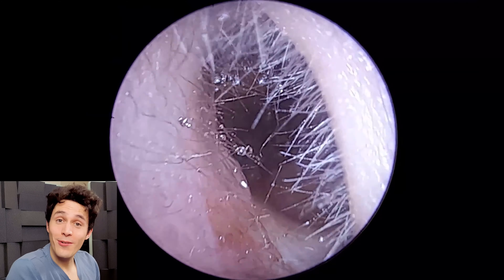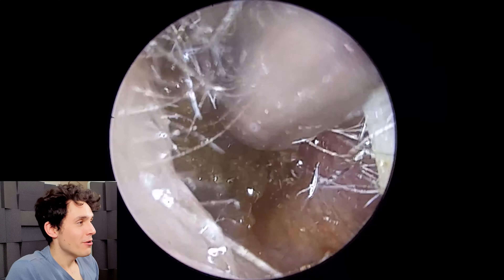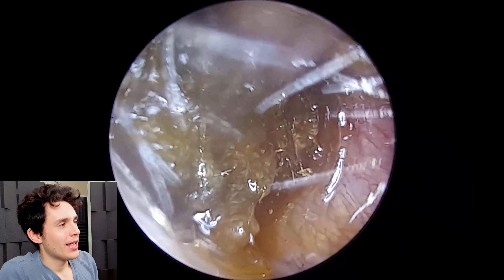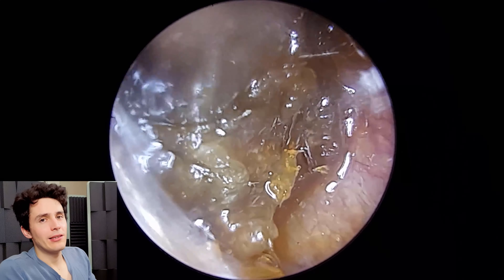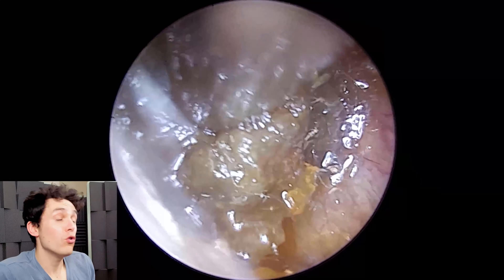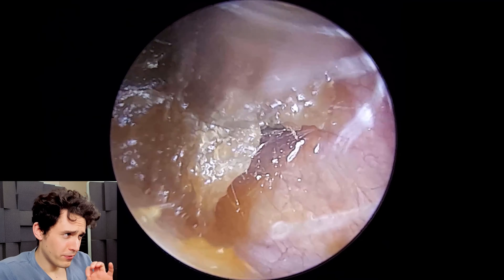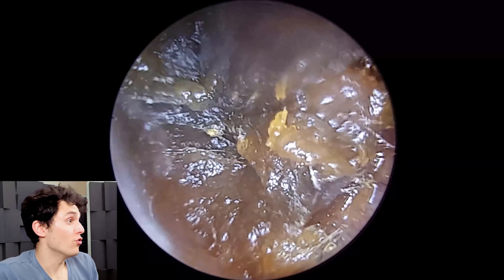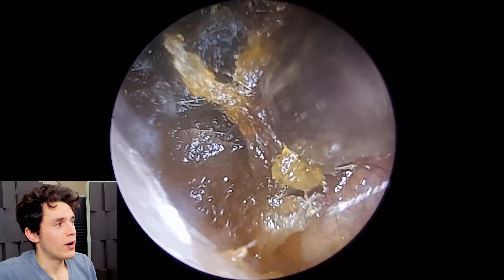Hi everyone, it's Connor here from Durham Hearing Specialists. I hope you're doing well and welcome to another video. We've got quite an interesting case here — what you're going to see in this video is ultra-sticky earwax. Normal earwax is sticky of course, but this is far more sticky than normal, and unfortunately it tends to block up the suction probe quite a bit.